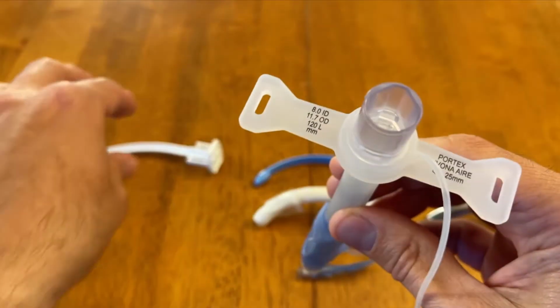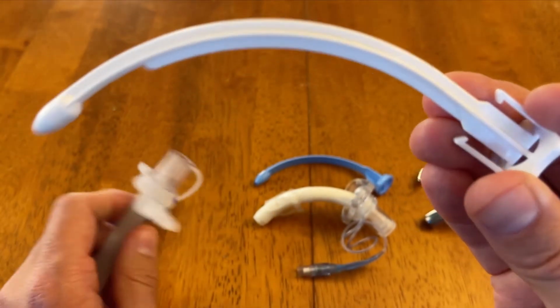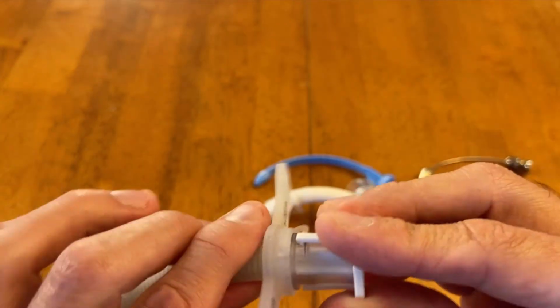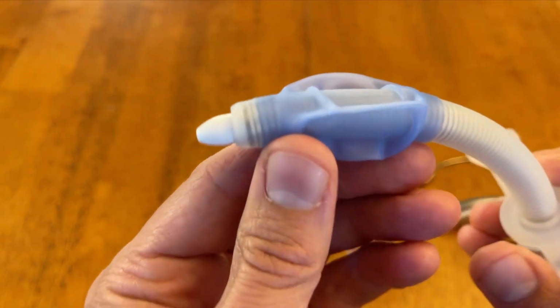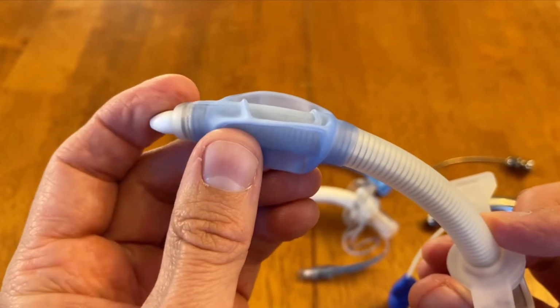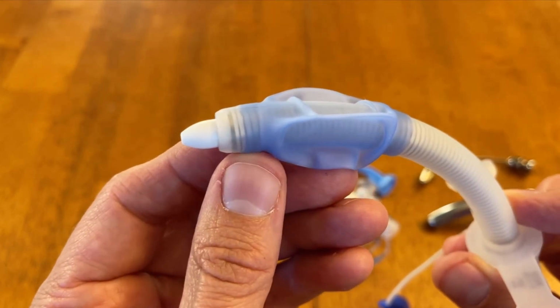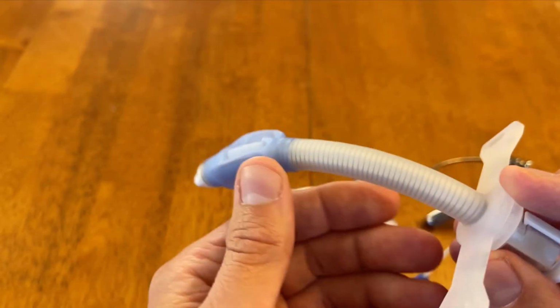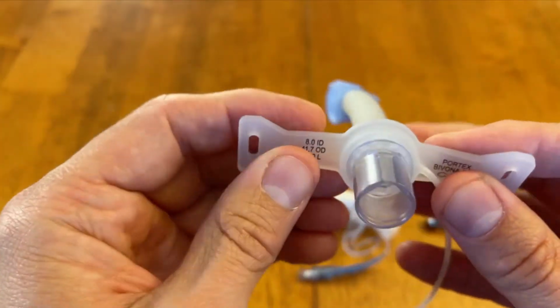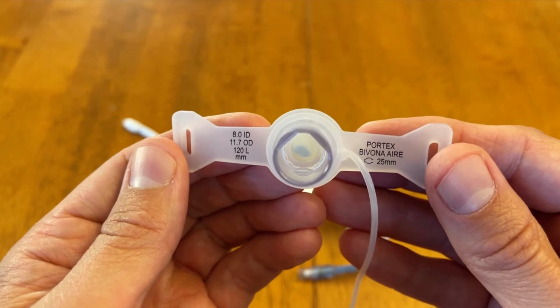Another thing I want to show you here is I'm going to reach over here and grab, when the tracheostomy is being inserted, we have what's called an obturator. So this is just during insertion. It's not left in during patient care, but it just goes inside, clicks in just like that, and this just facilitates the passage of the tracheostomy tube into the patient. You can see that it kind of provides a rounded, softer edge there for insertion that minimizes the risk for soft tissue injury on your patients. And of course, once that is placed in the patient, we take that out. Now this one does not have an inner cannula, so it just has the outer cannula here. I'm going to show you one here in just a moment that does have an inner cannula.